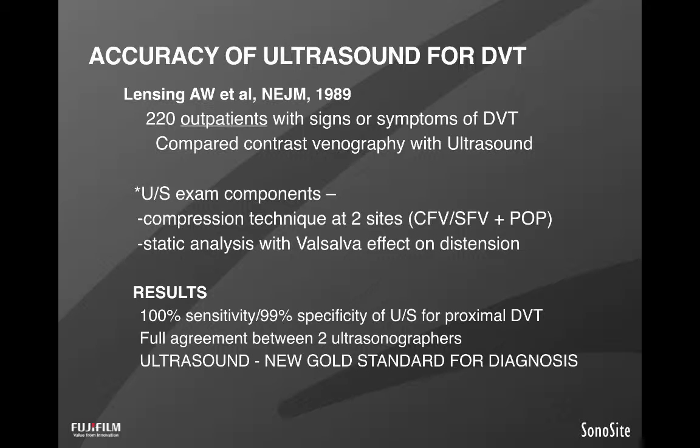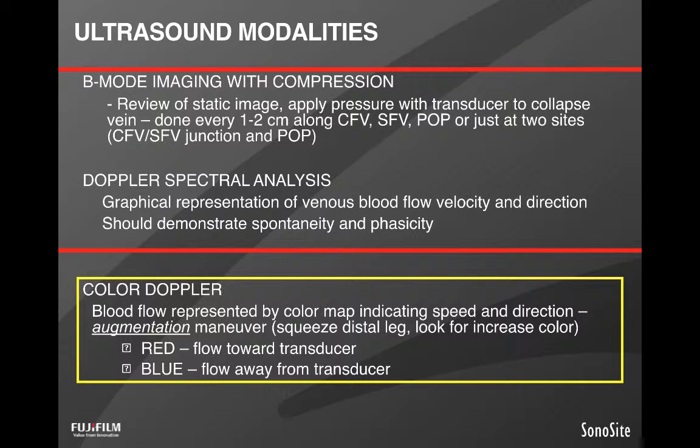So they really just looked at it and they asked the patient to do a Valsalva maneuver and they tried to see whether it distended on Valsalva. And what they found there was really, like I said, near perfect accuracy with full agreement between 2 sonographers. And based on that study, that was largely the new modality which has been used ever since.